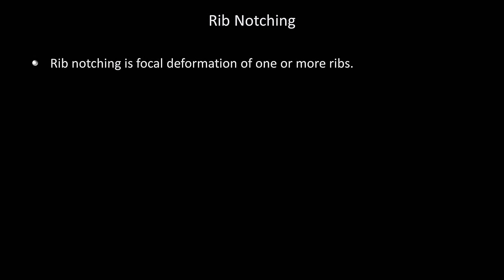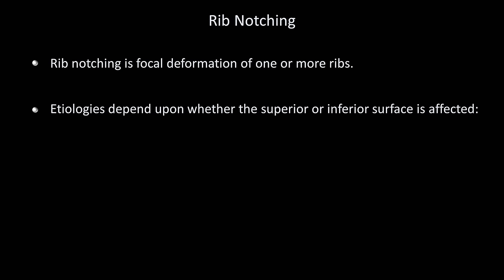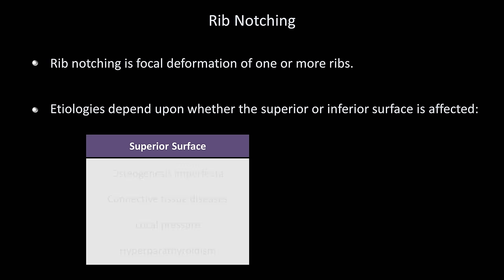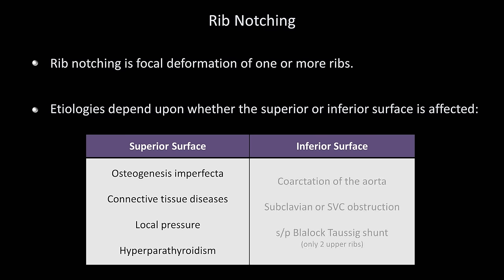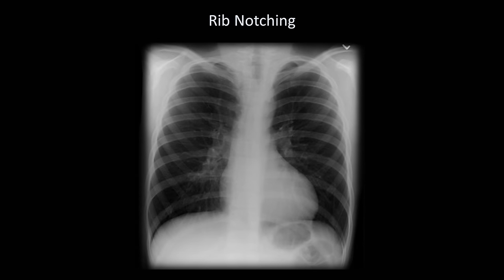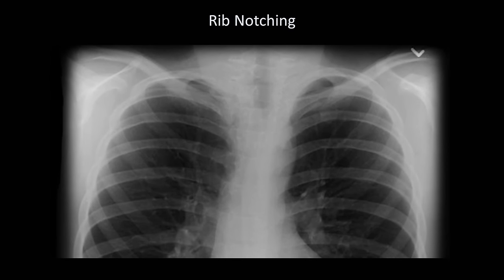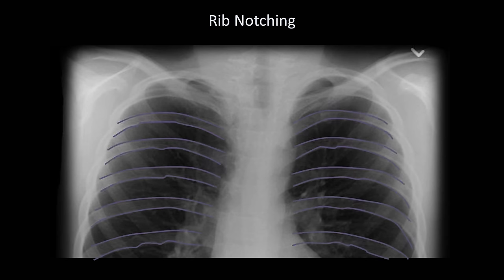Rib notching is the focal deformation of one or more ribs occurring on the rib surface. The etiologies depend upon whether the superior or inferior surface is affected. Notching on the superior surface (less common) can be seen in osteogenesis imperfecta, connective tissue diseases, local pressure, or hyperparathyroidism. Notching on the inferior surface (more common) can be seen in coarctation of the aorta, subclavian or SVC obstruction, and in patients status post a Blalock-Taussig shunt, in which only the two upper ribs will be notched. Notice how the superior surfaces of the ribs are smooth, while some inferior surfaces are ever so slightly jagged.